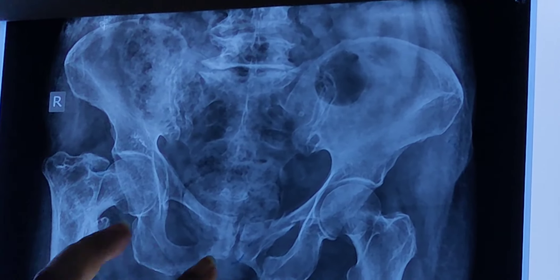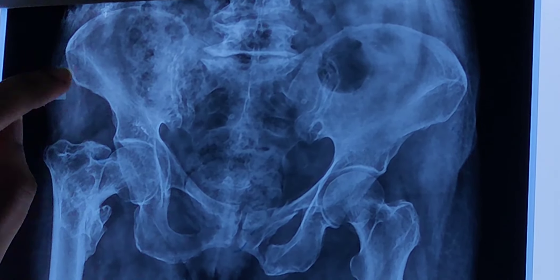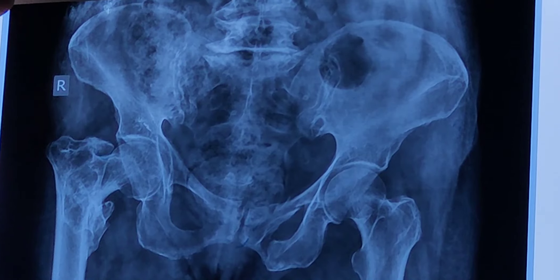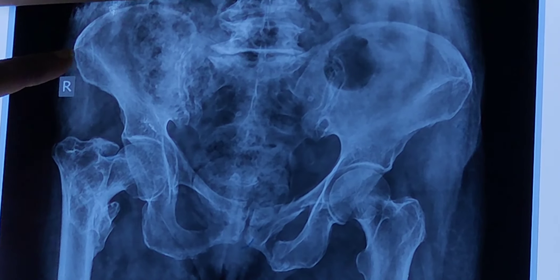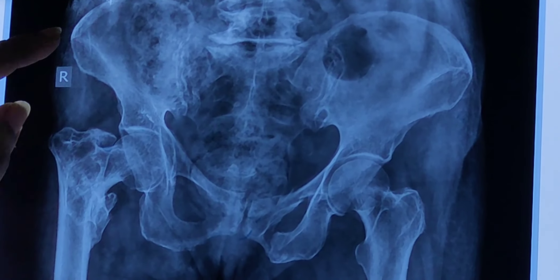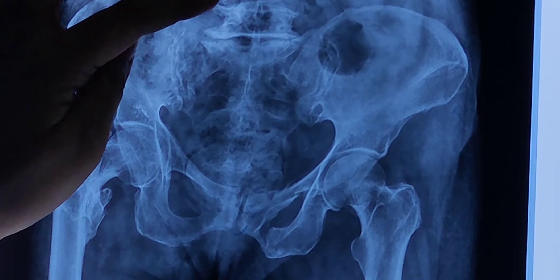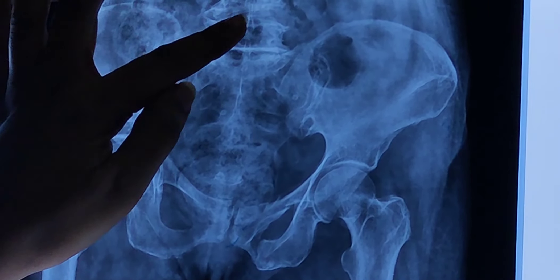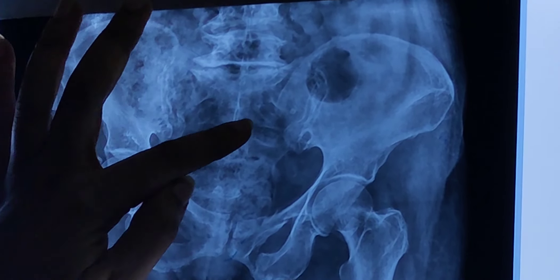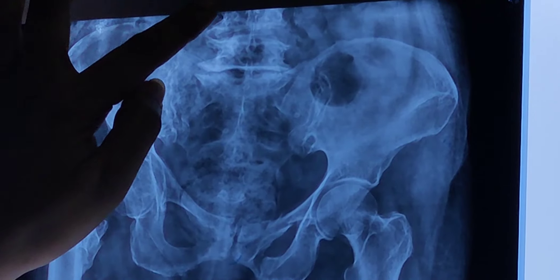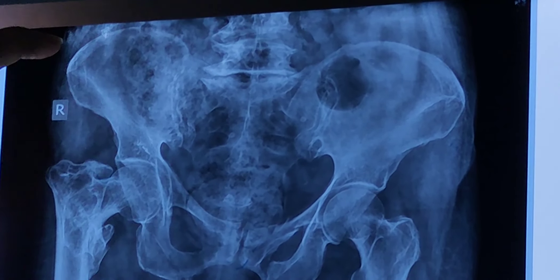Hello everyone. In this video we will see the X-ray of the hip joint. This is the AP view of the hip joint. Here we can see in the midline these are the lumbar spines, these are the lumbar vertebrae.